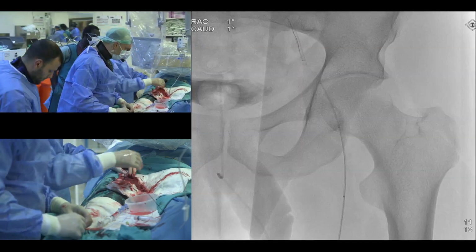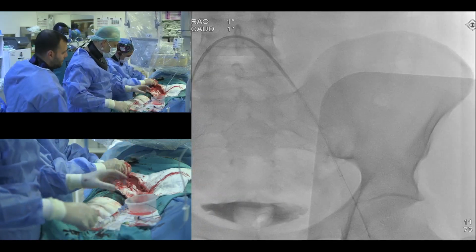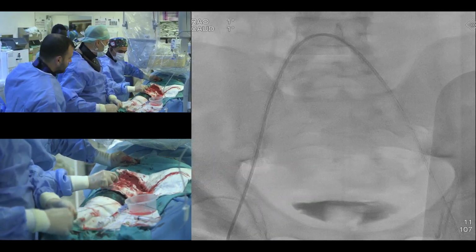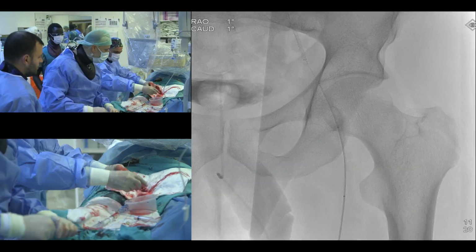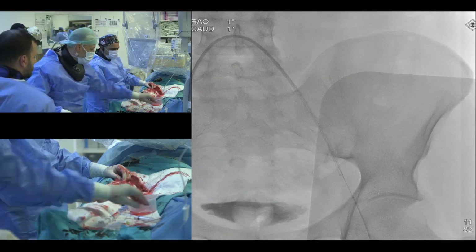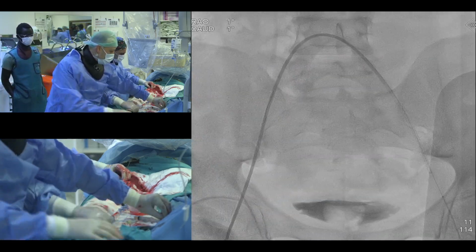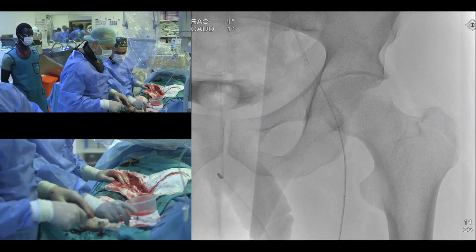Now we have externalized our guide wire from the right femoral. Evet. Çekiyorum ben. Çek, mikroyu çek alt geriye. Şu şiti tutar mısın? Burası bende zaten. Okay. Al. Tamam. Okey, tamamdır.